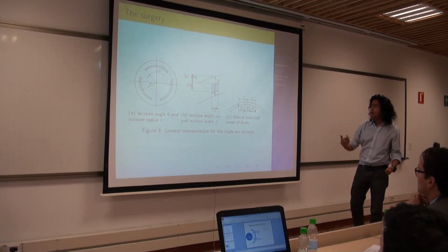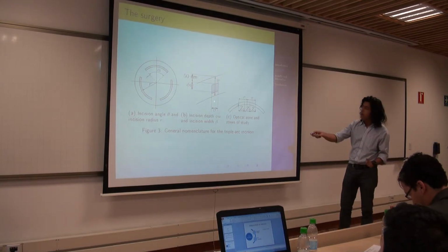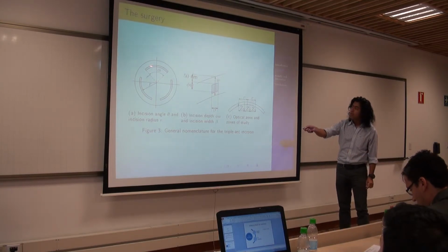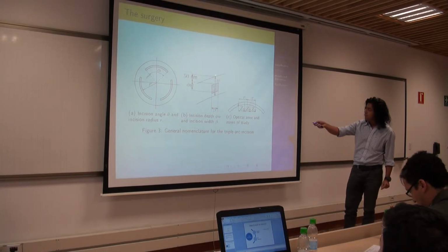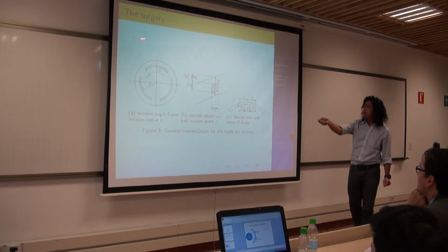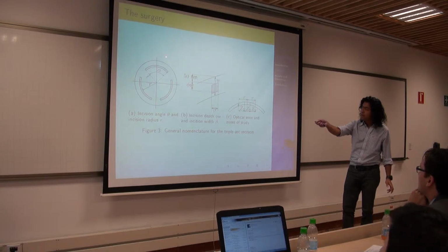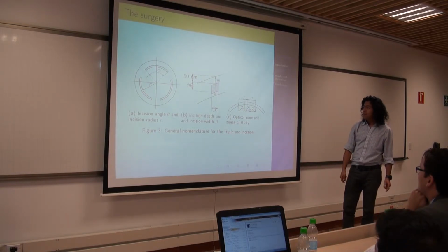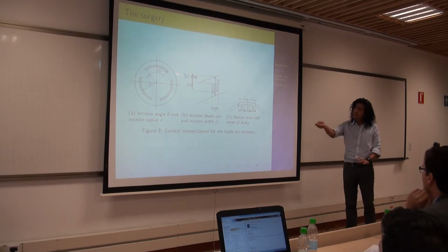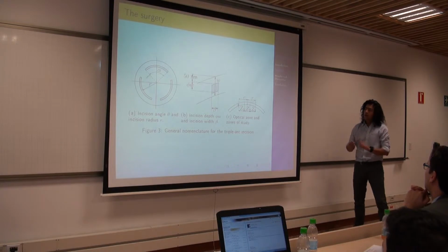They are arched, they are symmetrical, and we have four different parameters. We are varying this radius, we are varying this arch, we are also varying the depth of the incision and the width of the incision. That's a really new idea. Other surgeries, for example, use two incisions in parallel lines, and that's the way it's done. That's the surgery we are trying to simulate.